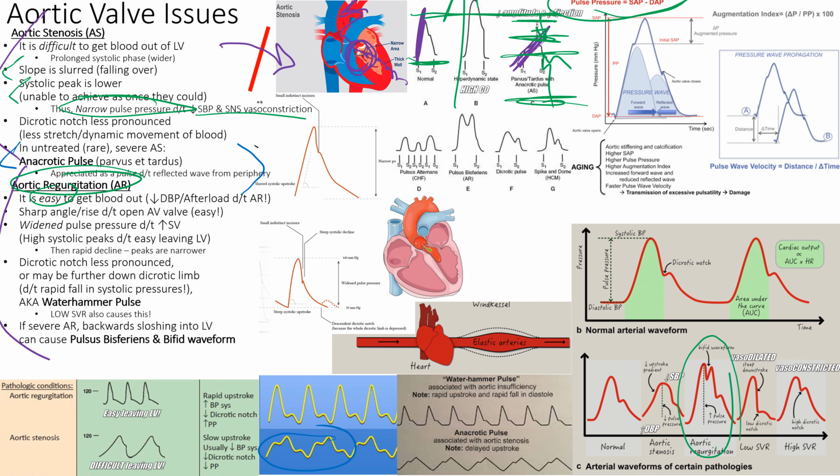It hits the periphery. It might bounce back, but we're definitely going to fall back into the left ventricle before that happens, and we're going to then bounce back. Right, while that valve is still open, you're going to see this characteristic double peak on the A line, and then the reflection from the periphery will then bounce back, and we'll get our little dichrotic notch, right?